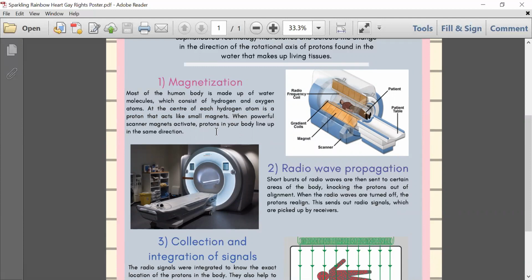So these water dipoles, when they are in our human body, rotate, translate, and vibrate, which means those charges are moving.